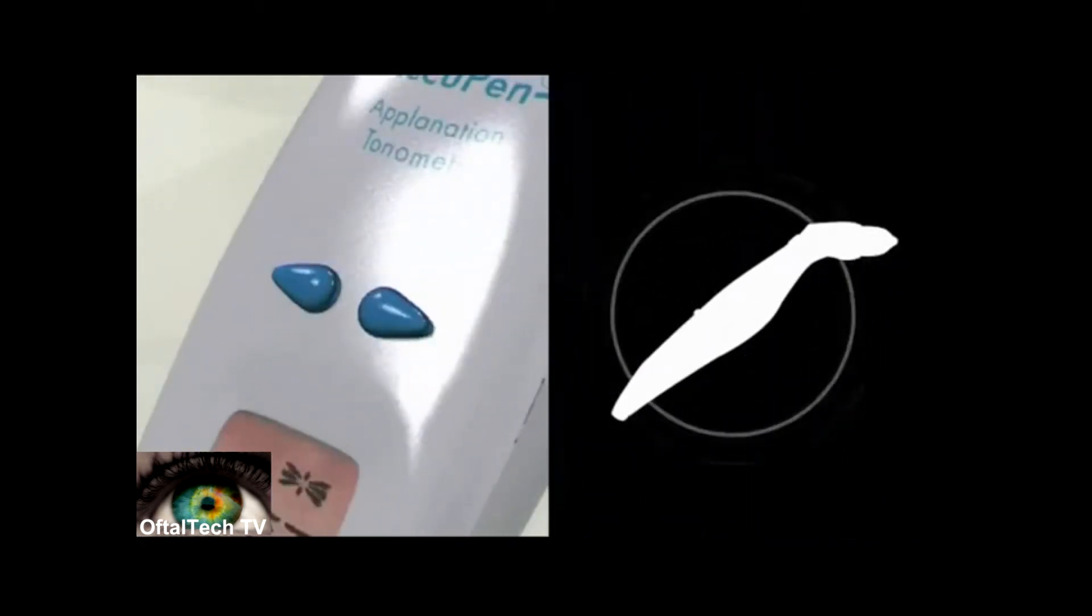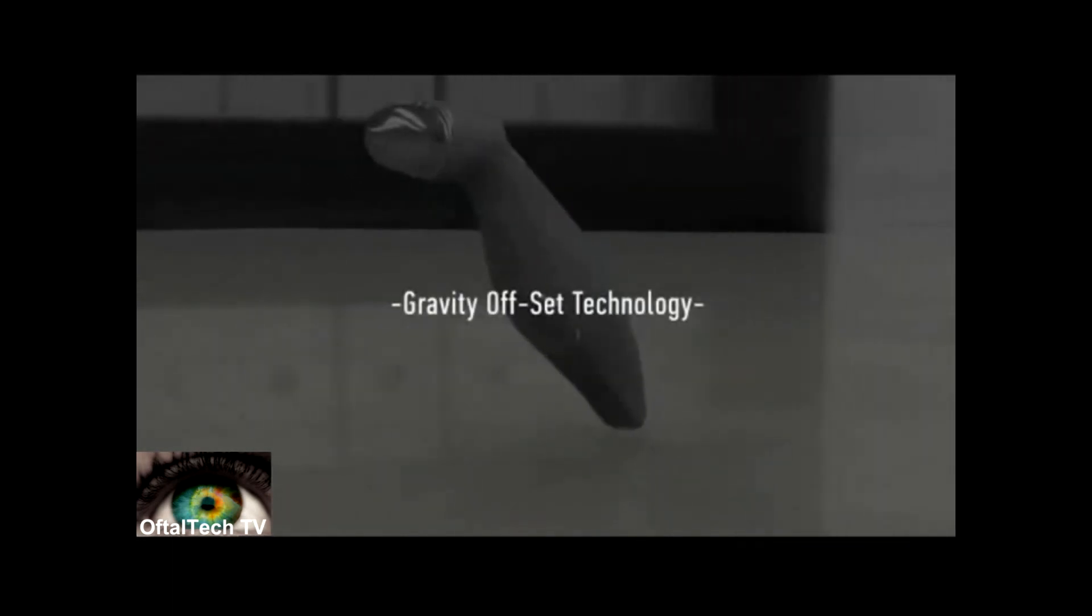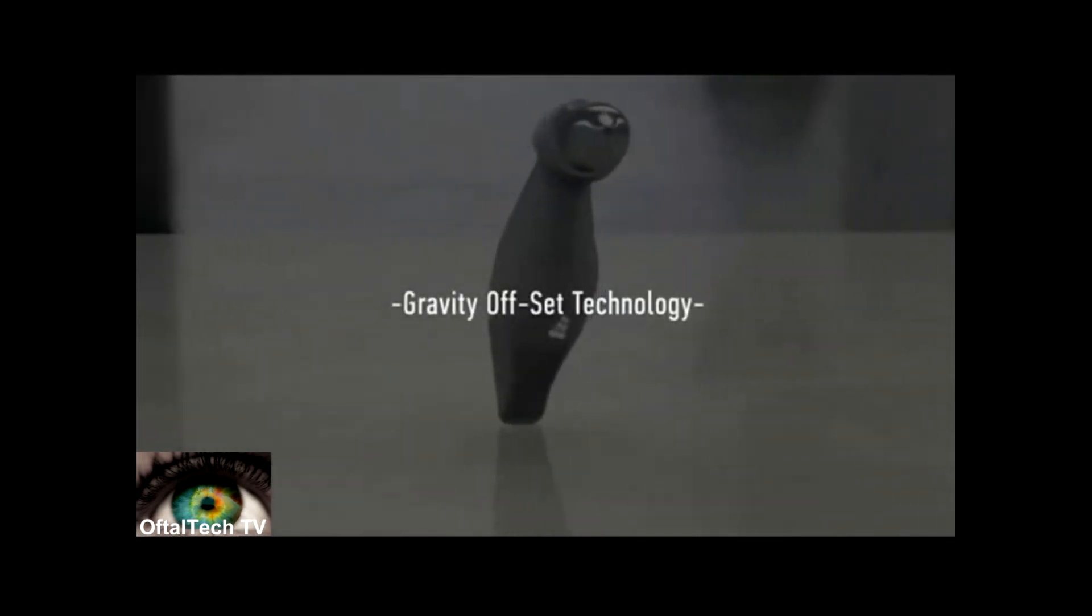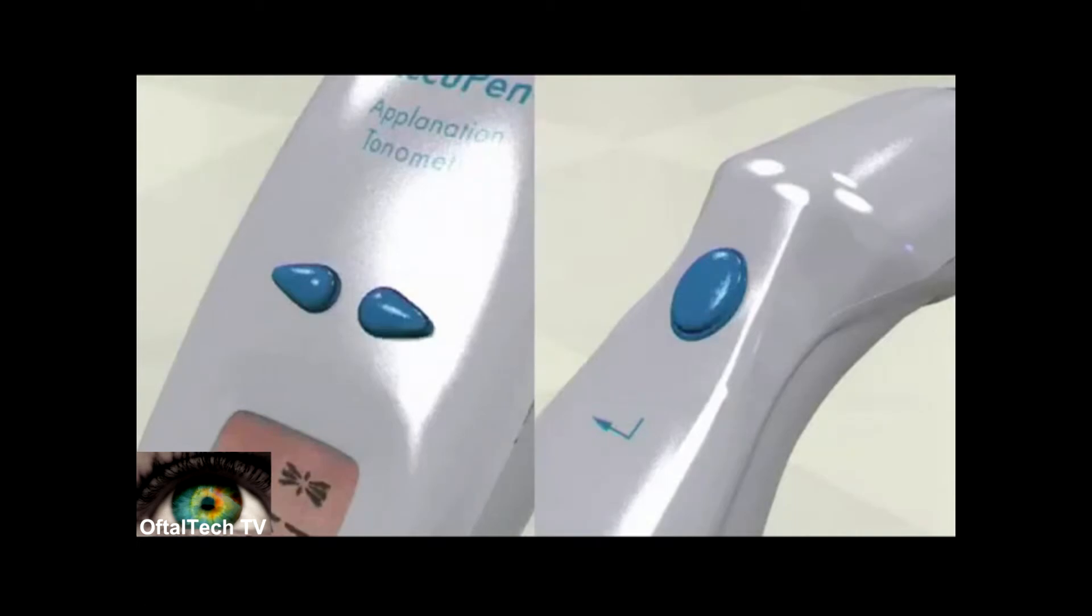The AccuPen features gravity offset technology, eliminating the need to calibrate your instrument frequently. When calibration is necessary, simply hold the up arrow and action button simultaneously for three seconds until the probe HORIZ display screen appears.